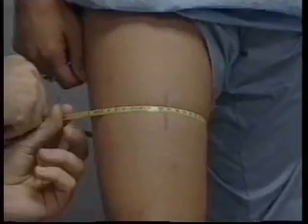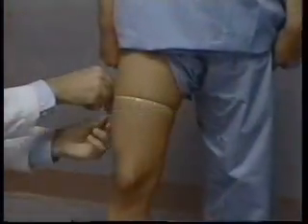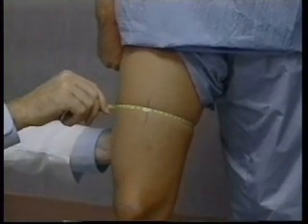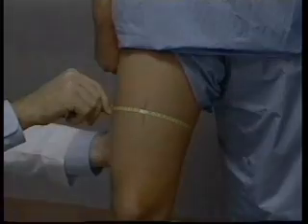The measuring tape is positioned on the skin perpendicular to the long axis of the thigh. The two ends of the overlapping tape are pulled together using care not to compress the skin and the underlying subcutaneous tissue. The thigh circumference measurement is recorded in centimeters to the nearest millimeter.